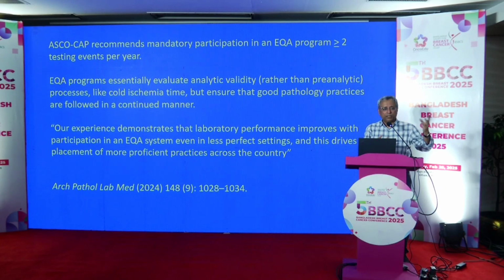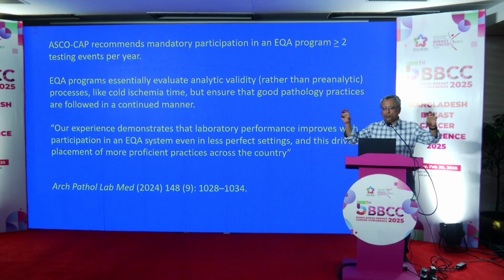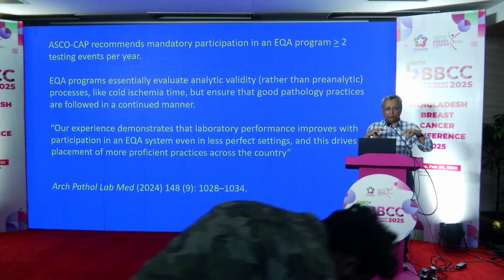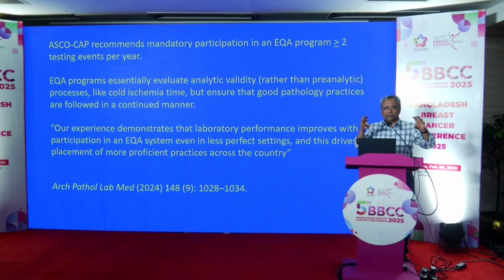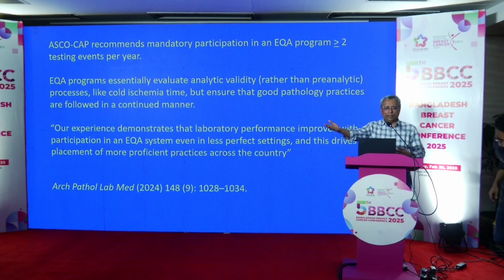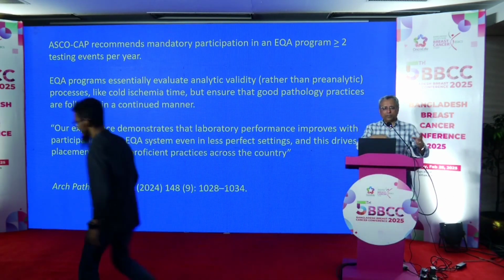You can extend that to regular H&E testing. It's not very difficult, but doing assays in silo, like you do in one lab 10 tests, another lab you do 80 tests, immunostain, and not really knowing what your problems are, in the long run, it actually causes problems for you. So what happens is, you do a stain, you call it positive, it goes to another lab and they call it negative, or vice versa.